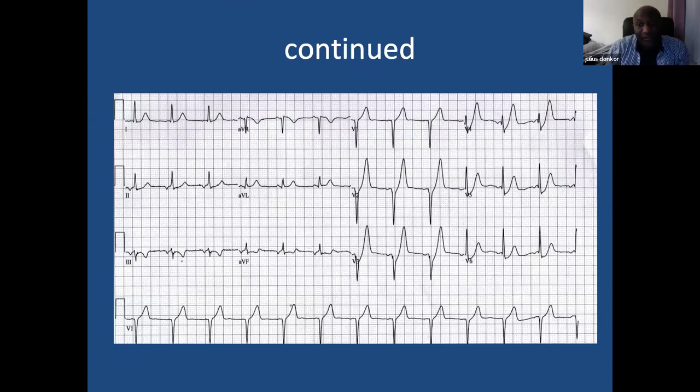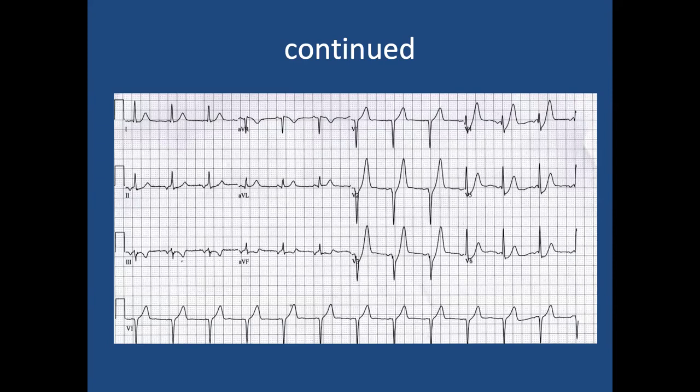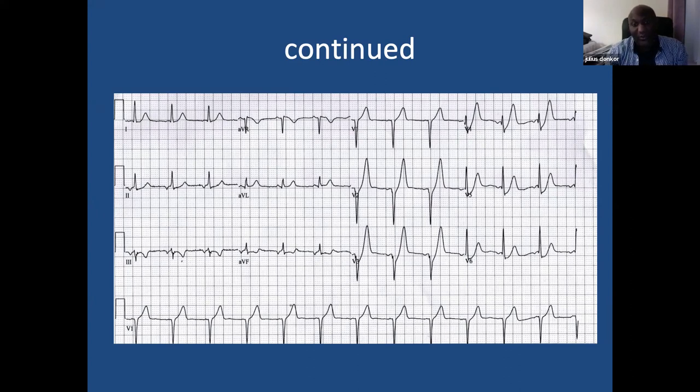So really what you're looking at is your hyperacute T wave, particularly in your V2, V3, and sometimes it extends into V4. Normally when you see widespread hyperacute T wave, you think hyperkalemia. But this is quite localized to V2, V3, and you've got a slight ST depression upsloping into your hyperacute T wave. So it's really characteristic of De Winter's T wave.